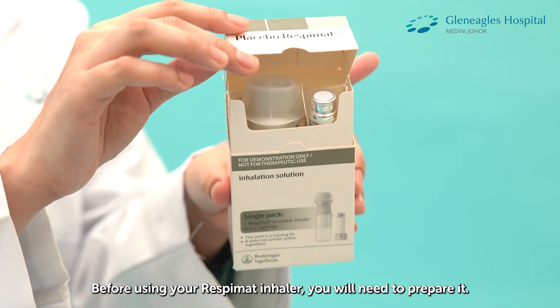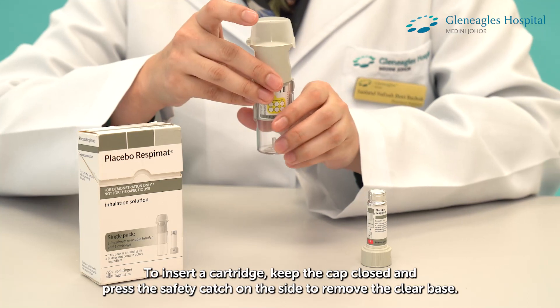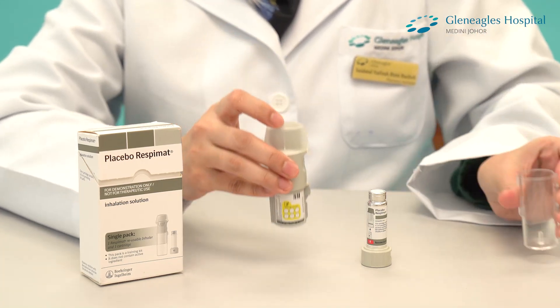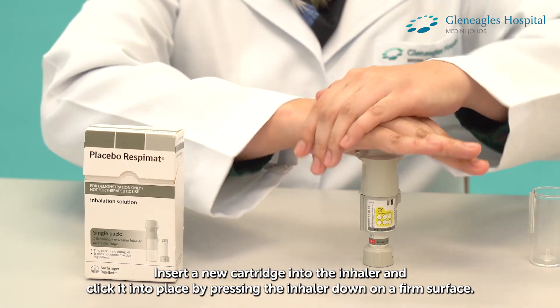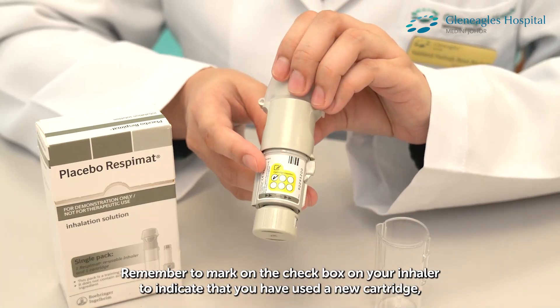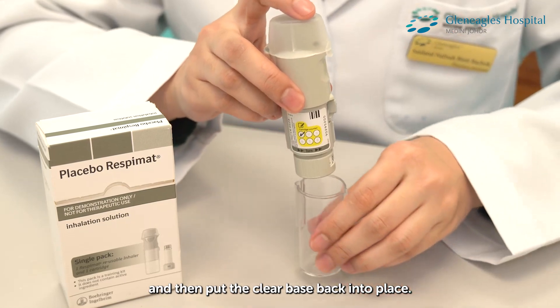Before using your Respimat inhaler, you will need to prepare it. To insert a cartridge, keep the cap closed and press the safety catch on the side to remove the clear base. Insert a new cartridge into the inhaler and click it into place by pressing the inhaler down on a firm surface. Remember to mark on the check box on the inhaler to indicate that you have used a new cartridge, and then put the clear base back into place.